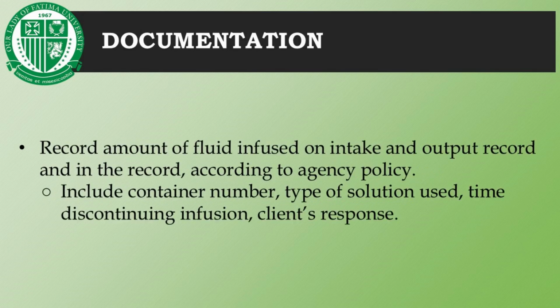For the documentation, the nurse should record the amount of fluid infused on intake and output record, and in the record, according to agency policy. Include container number, type of solution used, time discontinuing infusion, and client's response.